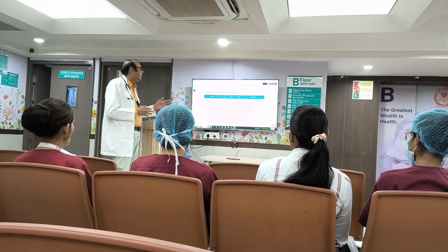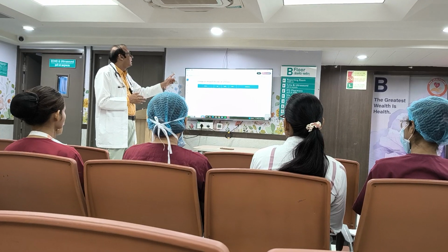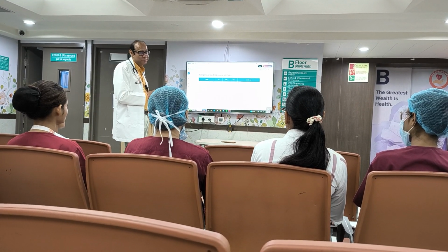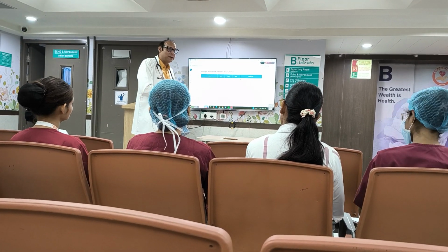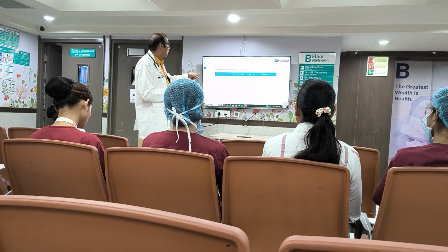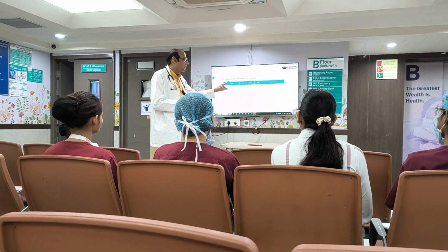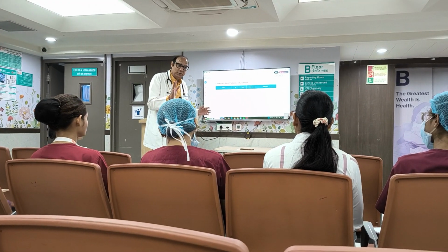Okay, and PCO2 will be normal, right? But bicarb is going to be low because bicarb indicates the metabolic part. You always have to understand that metabolic is controlled by bicarb, respiration is CO2. Okay, so in this case, which diseases can cause this? Any acute phase, it will show up in DKA, in sepsis, in renal failure. You got this point?